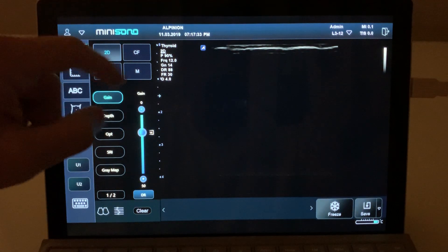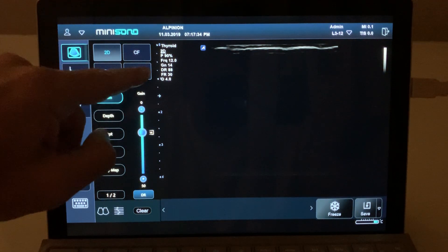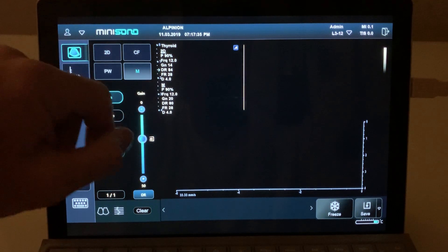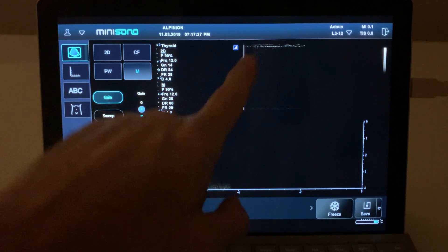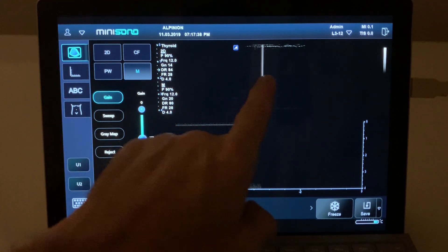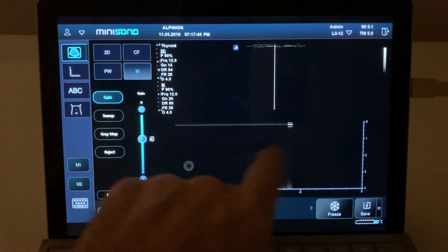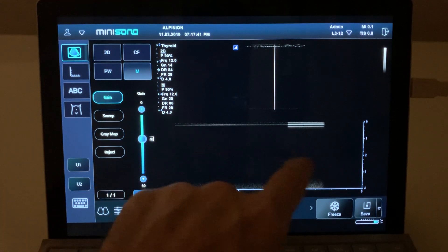If you ever want to do M-mode, click M-mode here and you will see the line for the M-mode. You can change the position of the line, and then the M-mode will be represented in the lower side of the screen.